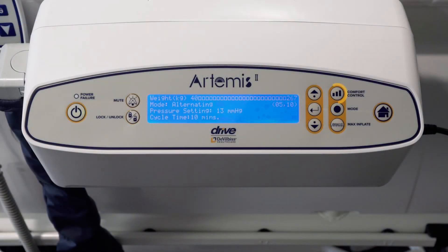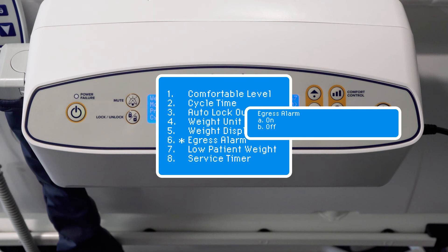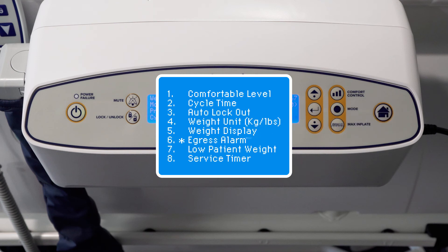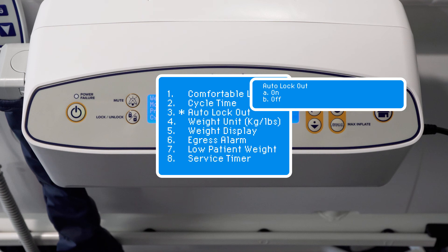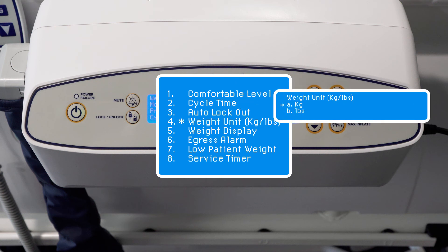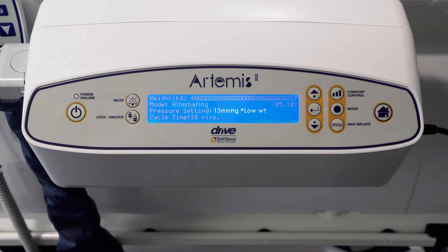To use the extended functions, press comfort control then press the down button to select the required function. These include: patient egress alarm (turn off and on) — if activated, the pump provides an audio-visual signal if it senses that the occupant has left the bed due to a sudden change in force on the cells; change of cycle time; auto lock where the interface will not automatically lock; weight display on/off; and weight in kilograms or pounds. A low weight pressure setting can be used for patients who are 40kg and under — 'low weight patient' will appear on the home screen and the pressure in the air cells will be significantly reduced. If the pump is turned off, the low weight setting will need to be reset.